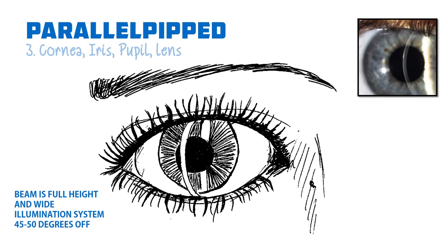Next, the parallelepiped is used to examine the cornea, iris, pupil and lens. This is a beam that's full height and wide. The illumination system this time is 45 to 50 degrees off. Start with the cornea and scan across it. Here you're looking for a clear cornea, and it's only when you find an issue with the cornea that you would zoom in.